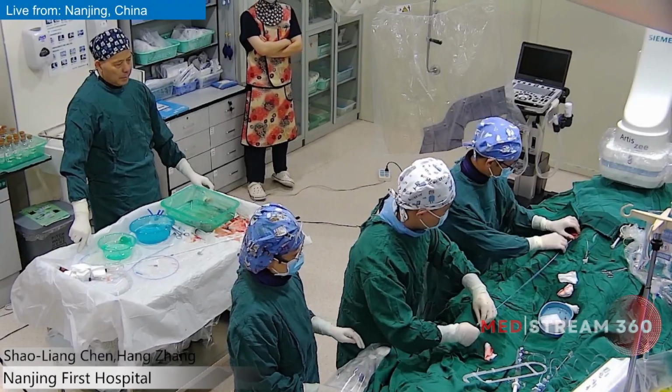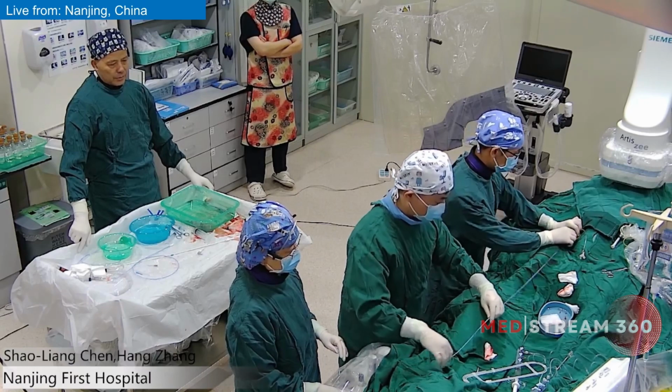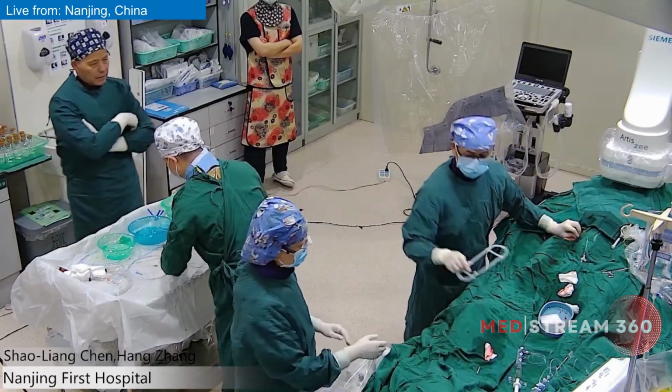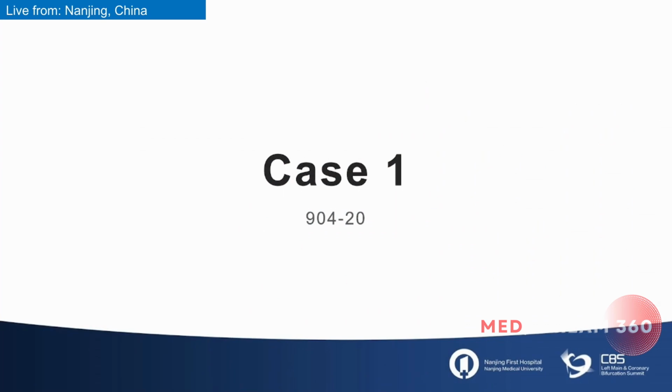...be the pulmonary artery denervation for pulmonary hypertension secondary to left heart failure. So first of all, I will invite my colleague Dr. Zhang Juan to introduce the patient history. Go ahead, Dr. Zhang Juan.